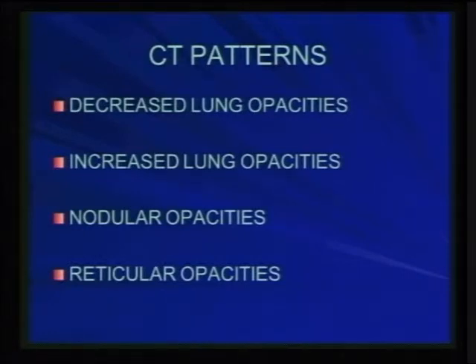Those really do not respect any boundaries within the secondary pulmonary lobules. And talking about nodular disease, talking mainly about lung cancer, it will not respect any boundaries and it will destroy things around. Nodular opacities can be seen as single pulmonary nodules, and we're going to have a whole discussion on that toward the end of my talks. But you can also have multiple nodular opacities, but their distribution is the one that's going to help us determine what may be the cause of the nodular opacities. And then you have the reticular or linear opacities, and those are basically a reflection of interstitial lung disease, as I showed you before, the framework of interlobular septa outlining secondary pulmonary lobules.